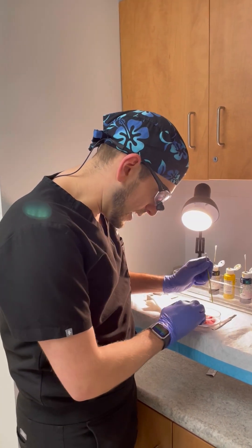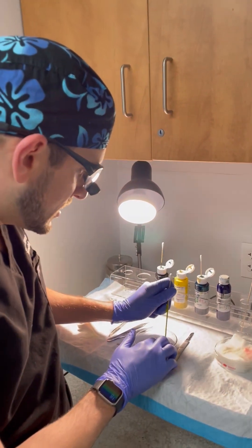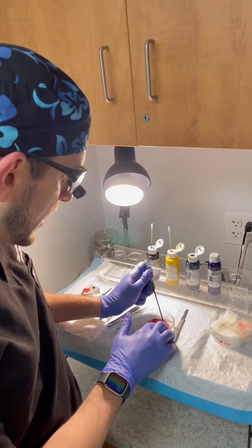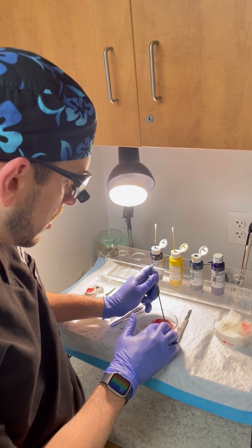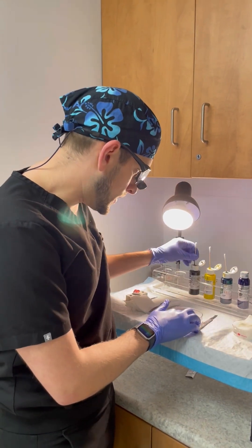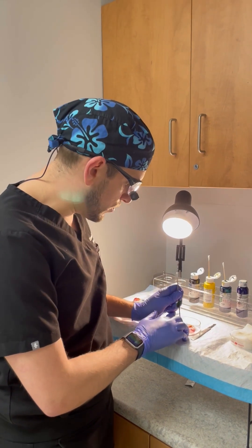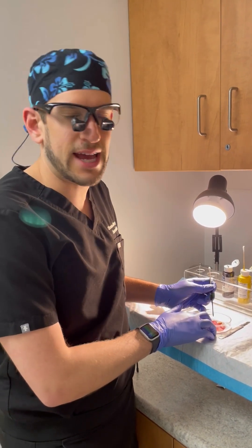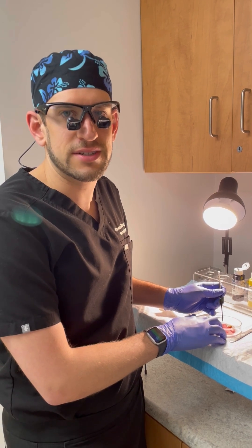What you'll see me doing here is inking the tissue, and this helps us orient which way is 12 o'clock, 6 o'clock, 3 and 9, etc. Just so that if we're seeing residual skin cancer at the edges, we know exactly where to go back on the patient's body.